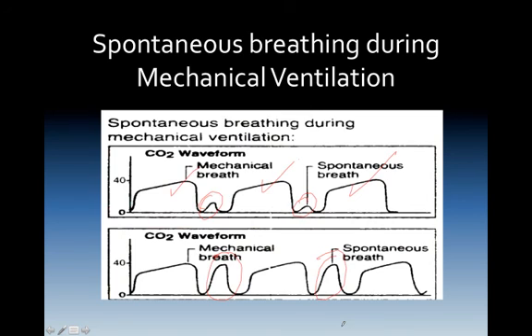If they are erratic, then very simply provide more knockdown drug. An example of this at IMSA, we would provide some more Versed at that point, or consider calling in a consult for an alternate dose of whatever you might have on the truck.